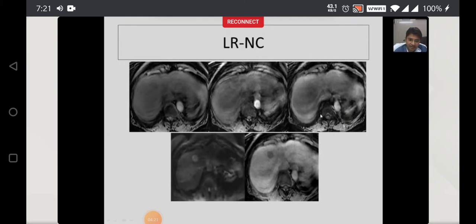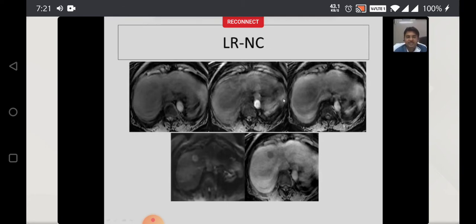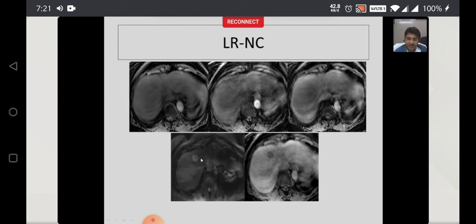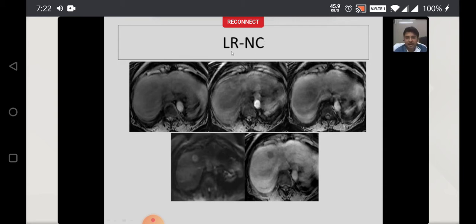What is LRNC? If you see these five images from the same patient in different phases — arterial phase shows artifact, portal venous phase also shows artifact — but diffusion-weighted images and the hepatobiliary phase are acquired well. In these cases, you have to label these lesions as LRNC because the images were either not acquired properly or were omitted. Best to report: there is a lesion of this size, not definitely able to characterize, but it shows diffusion restriction and a defect in the hepatobiliary phase, suggesting possible HCC requiring further imaging. You can put this as LRNC — not categorizable lesion.